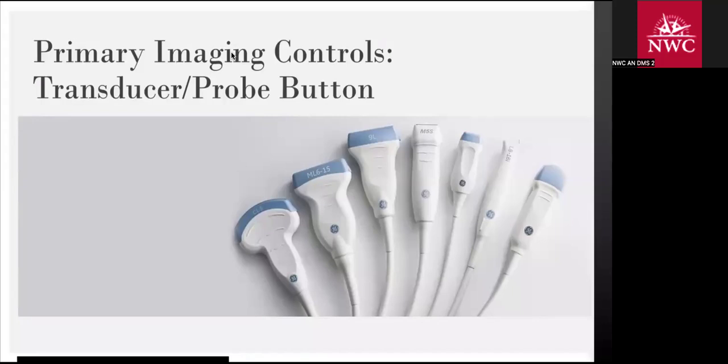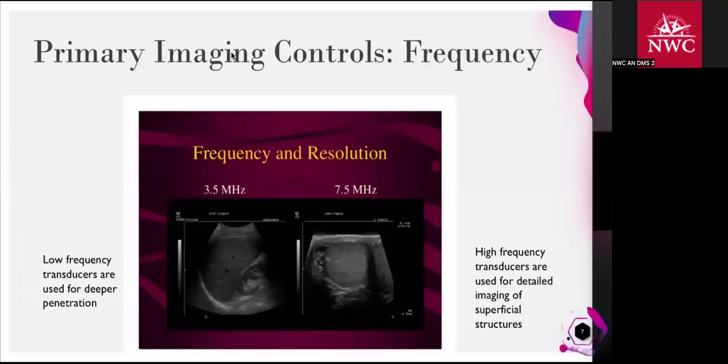And so you want to know that frequency. It says better tissue resolution of superficial structures is attained with high frequency. So tissue resolution is like tissue accuracy. So if you want accuracy in your image, you're going to choose that higher frequency transducer. So here is an example of using a 7.5, which is higher than a 3.5, right? So this would be my high frequency. And you could see that the image is just a little bit more crisp, more clean, more detailed.